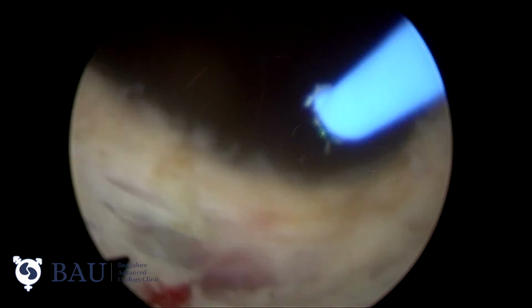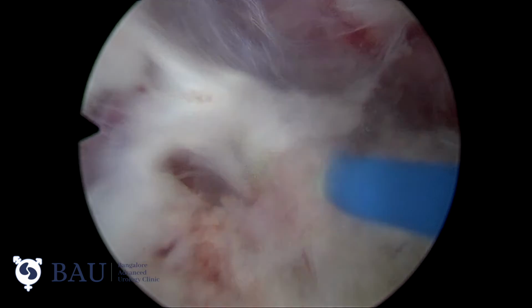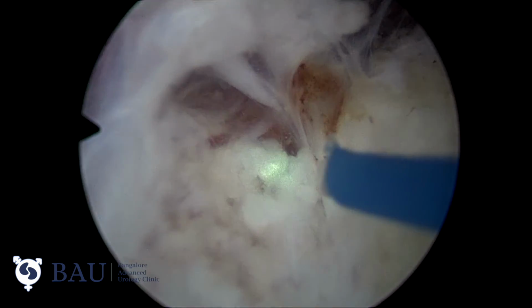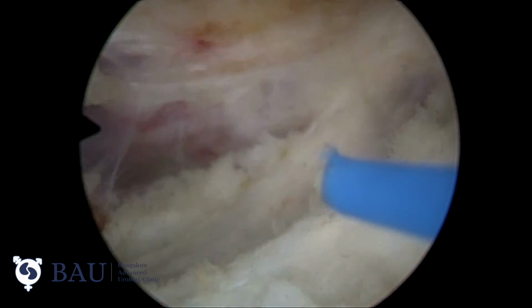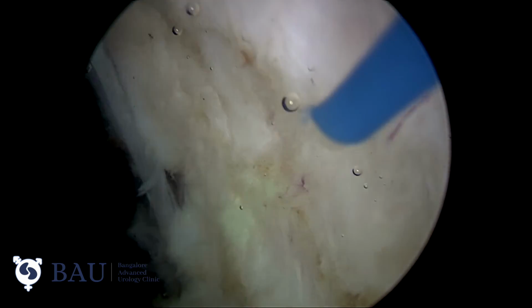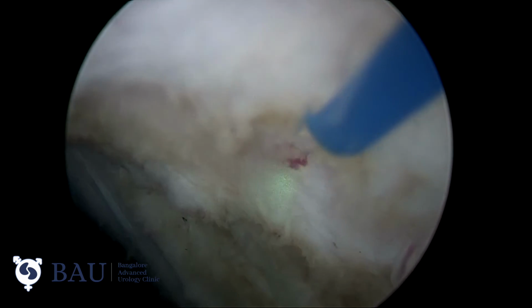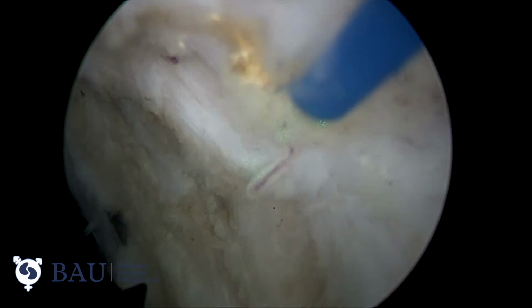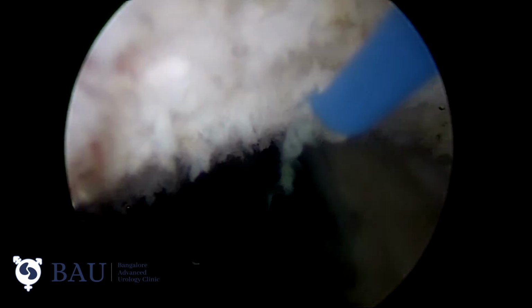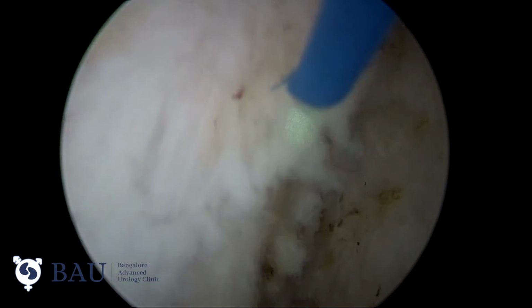And also check for any bleeder in the capsule. Here you can see a little bit of undermining during dissection. Here the capsule was very thin. You can appreciate absolute zero bleeding. In some places I am coagulating just as a precaution.